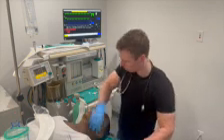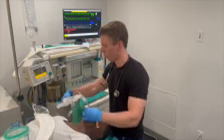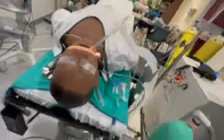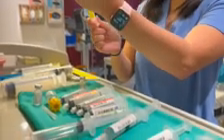Congratulations, you have successfully anesthetized a patient, secured their airway, and connected them to the ventilator for a general anesthetic. Our job doesn't end here, though. This will be a busy time when everyone in the operating room is preparing for the procedure. What you are getting ready will vary depending on the surgery, but consistently, a few things that you will likely need to do include placing a temperature probe, placing a cocoon, bear hugger, or other passive warming device, and administering the antibiotic and antiemetic medications.